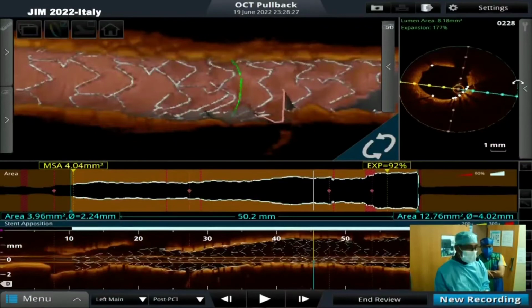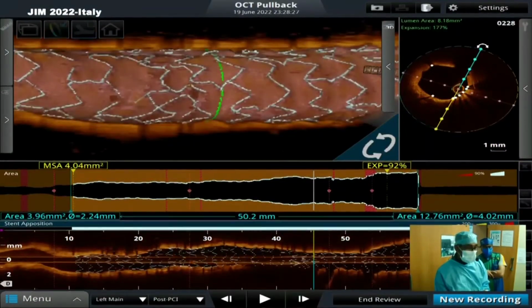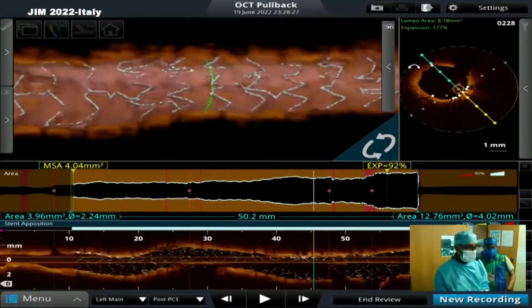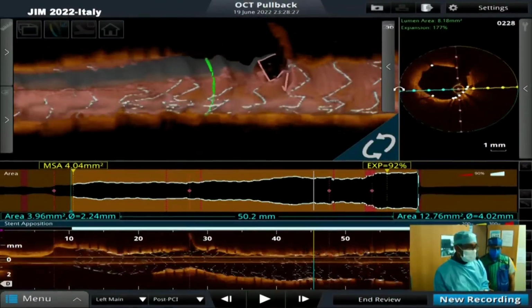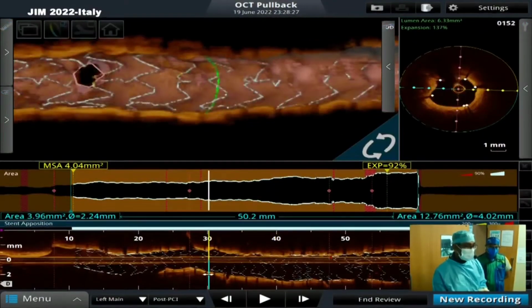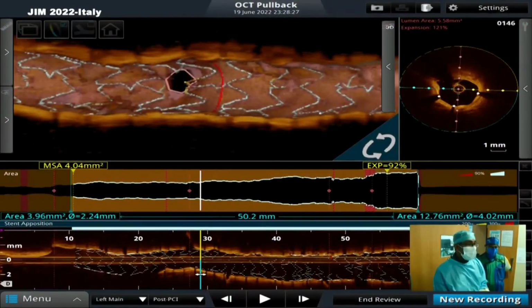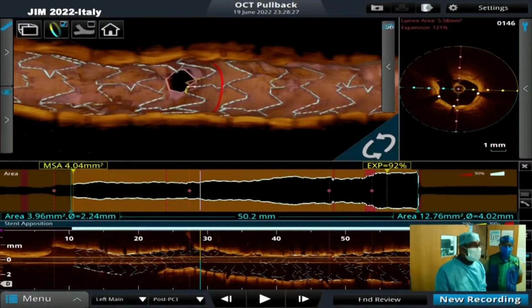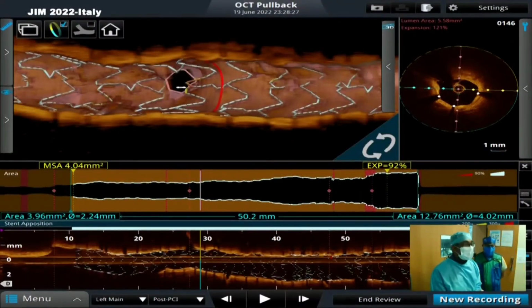No, I'm saying, you can leave it. Definitely, I think I would not do anything. But since we're doing precision PCI, you're going to do the OCT after we go off camera, and you're going to email me the result about the mid lesion and the ostium. Personally, I'm curious, but it doesn't have to be part of the live case. We can successfully complete it on time, and you did a great job. No need. One diagonal ostium over here, which looks really good.